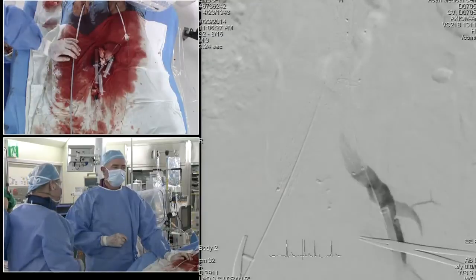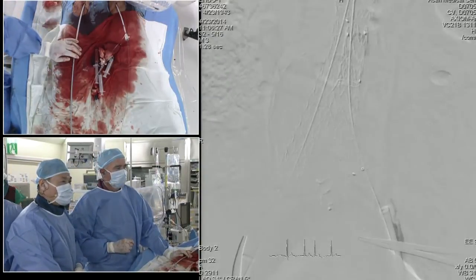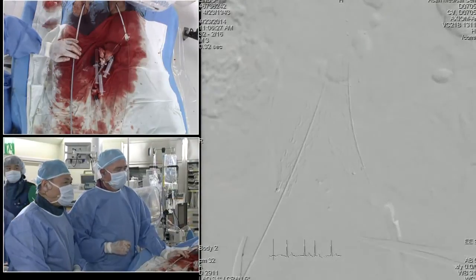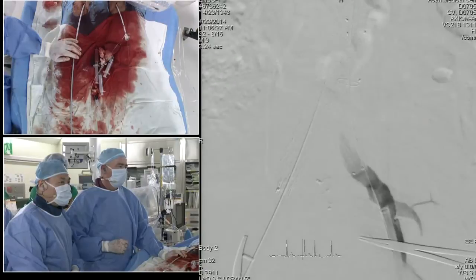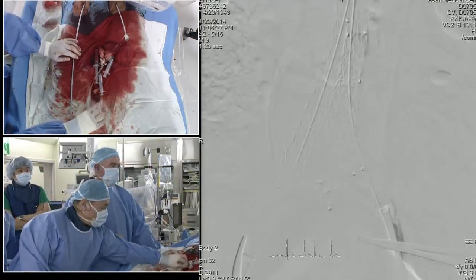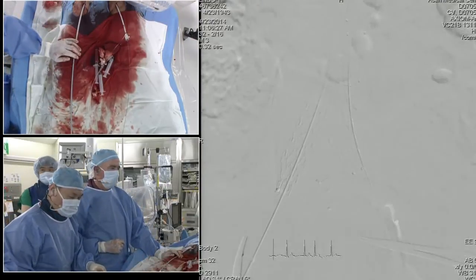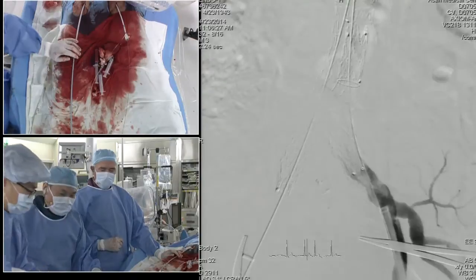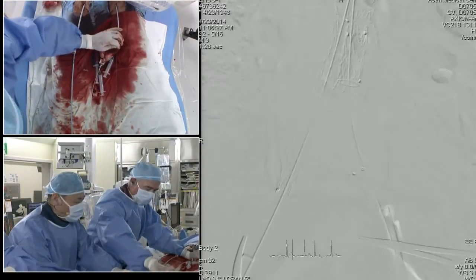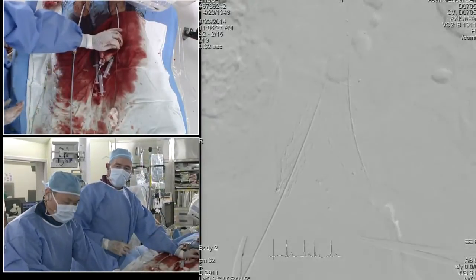John, as you're waiting for your device, and for people with more experience, if you had to get close to the internal, or if you had to inadvertently cover bilateral internals, what's been your experience there? What have you had to do? Well, I haven't done it, quite honestly. I've really been loath to do that over the years, and if you're going to do it, we'd like to do it in a staged manner. So I wouldn't like to do it in this kind of situation where we're closing both internals and the IMA at the same time.